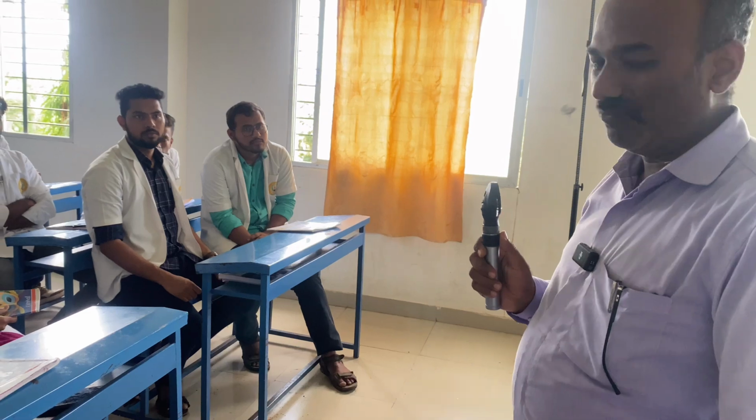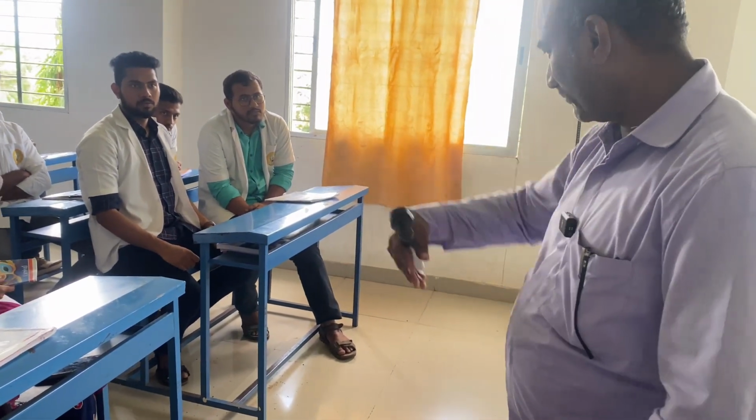Direct distance ophthalmoscopy is meant to identify the glow of the patient that gives you the estimate of vision. The second is to identify the media opacities. Close ophthalmoscopy is for identification of only the posterior segment, where you have to approach closer.